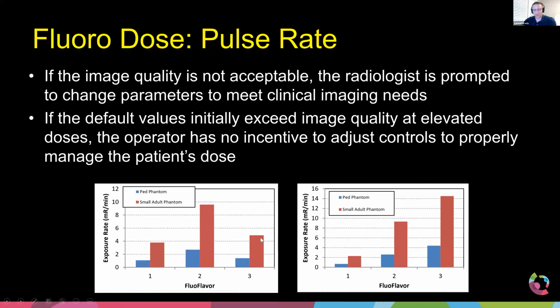And every time I would go in to service and work on this machine, I would adjust it. And then I'd go back the next year and it was all mixed up again. Every time the service engineer would come in to do their PMs, their routine periodic maintenance, they would take away all of my corrections and reload the software. They would basically refresh the system.